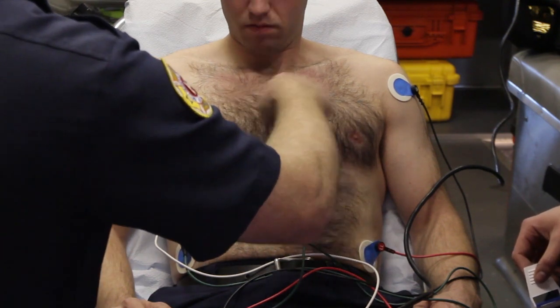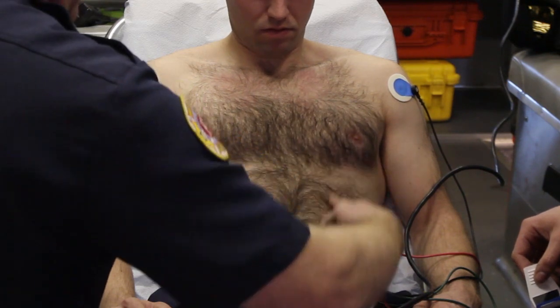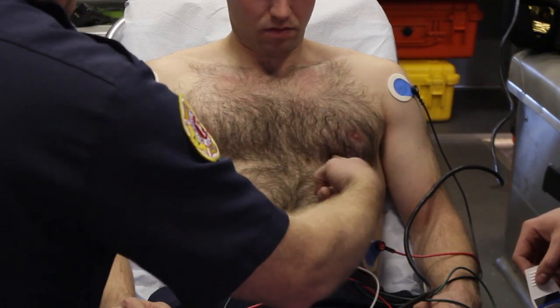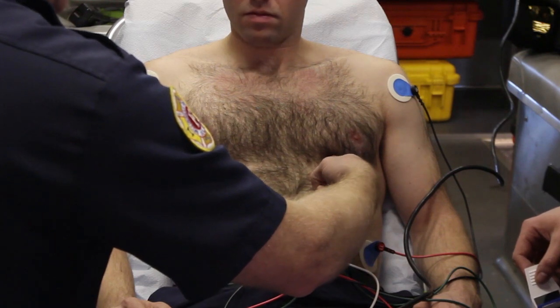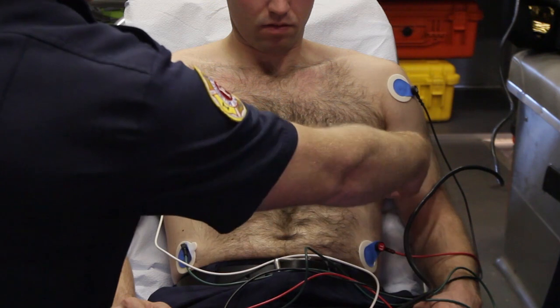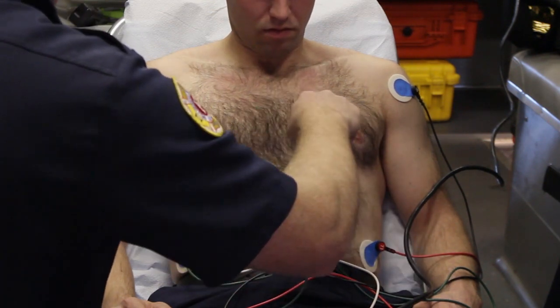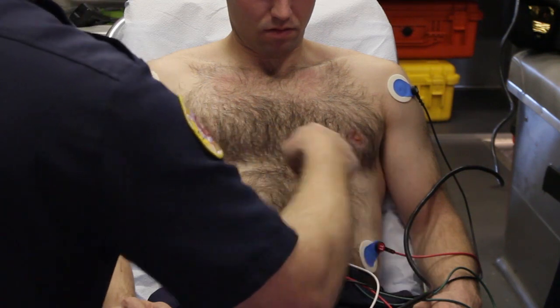What I would do is just shave here, shave here, and then you know you're going to have one here, one mid-clavicular here, right in that fold that all humans have, male or female, and then you're going to be following it up like this around here. So the shave spots should be here, here, here, and then a little bit here.